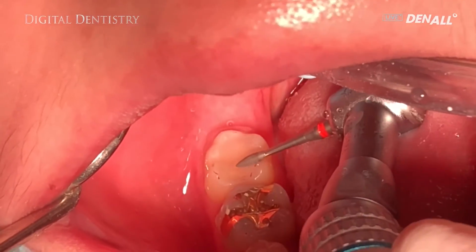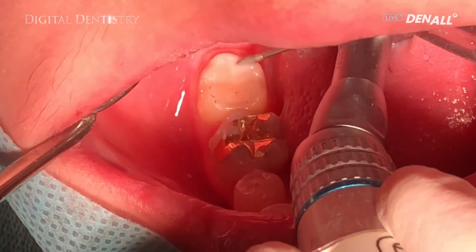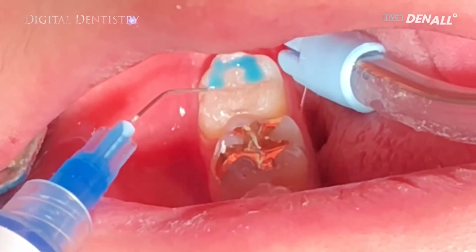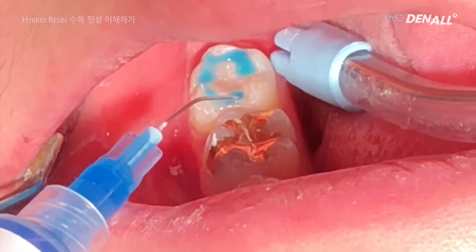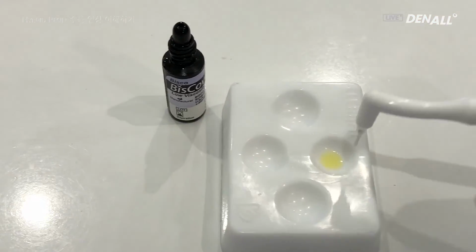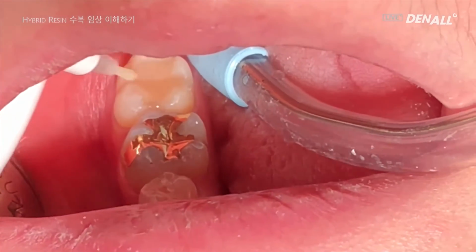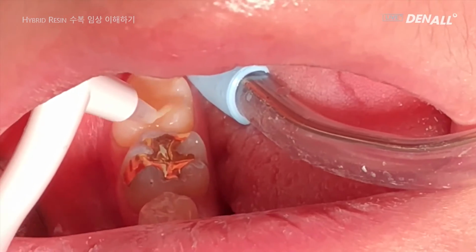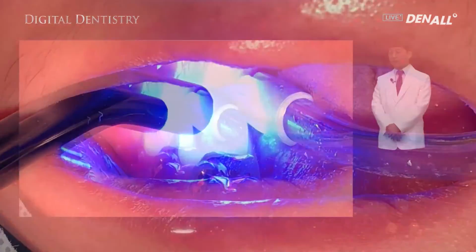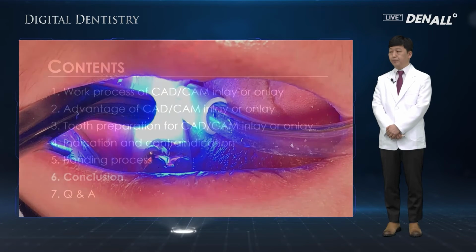Use a low speed burr, a dedicated burr, to do final occlusal adjustment and polishing. You etch the margin to prevent leakage, and after this is done, you use Viscover. It is a dedicated coating gel, and then all processes included in the inlay bonding process are complete. Bonding is done.